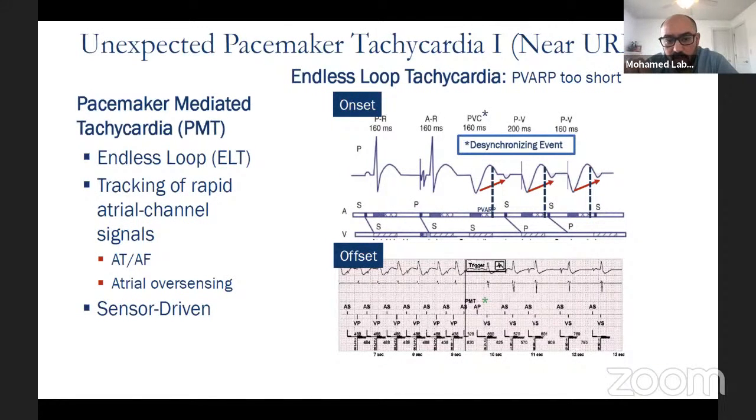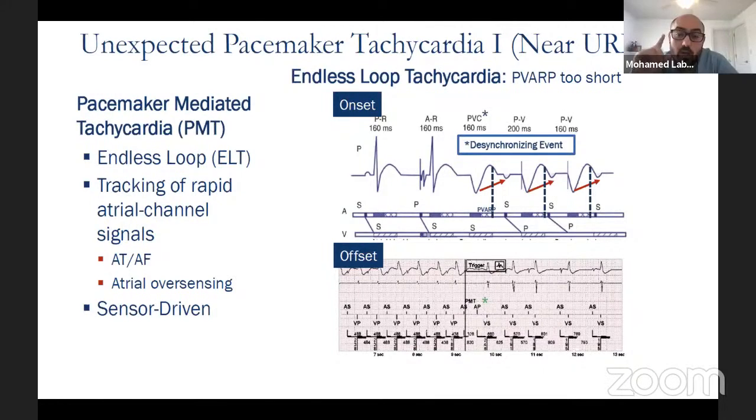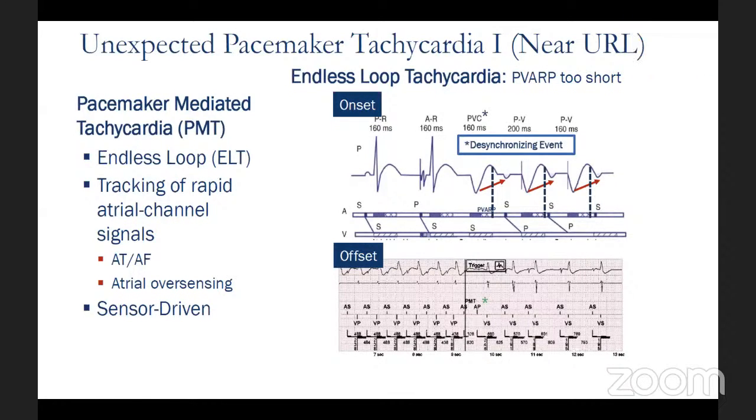If it's a pacemaker that I think is within a year and a half, two years maximum, I can just pull it out. I would do that, if that's your question. Yeah, no, thank you, just to cover that. So do you use laser extraction for the lead? No, it depends on the duration, whether it's recent or old.